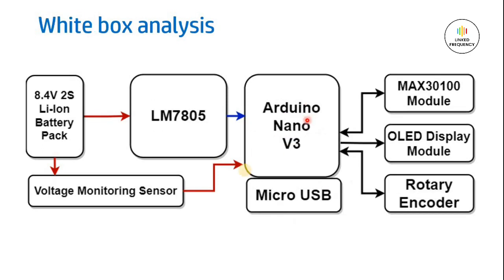Now, if you go for the white box analysis, you can see here, in the case of the lithium-ion battery pack, we are selecting an 8.4 volt 2 series lithium-ion battery pack. Why? Because we want a greater voltage than the minimum voltage required for the Arduino Nano development board or the MAX30100 module. Then only the entire circuit works. That's why we have the 8.4 volt combination so that we can convert it further into 5 volt by using an LM7805 voltage regulator.